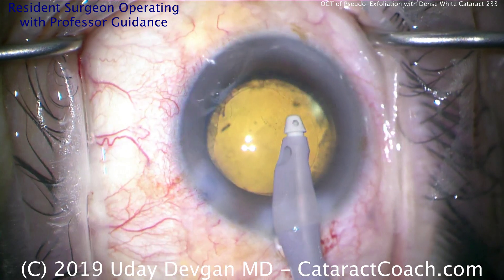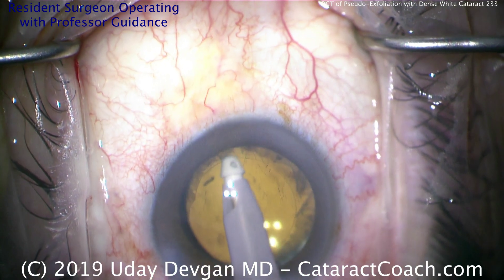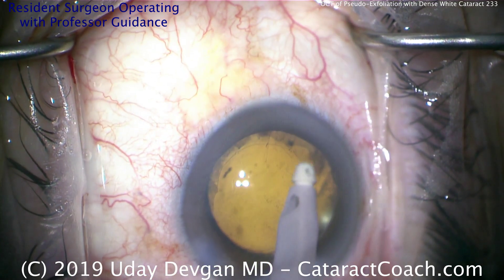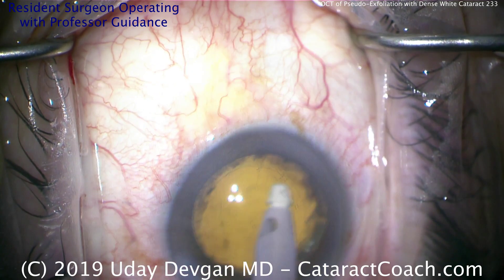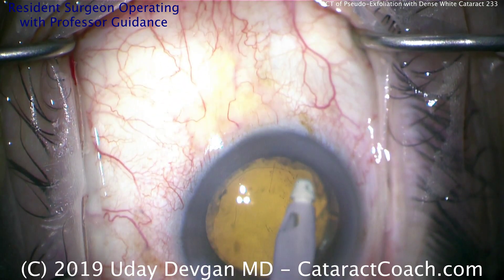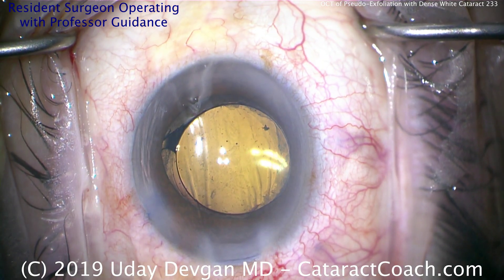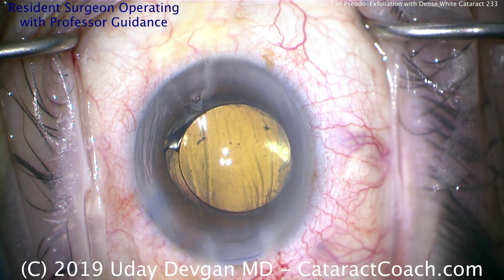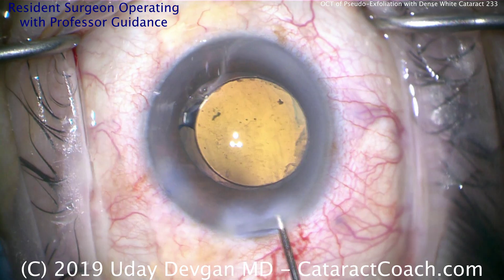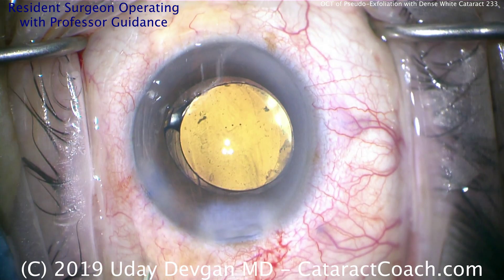That capsulorhexis size — let's judge that. Looks like it's a good 5mm capsulorhexis, given that the optic is 6mm in diameter. That looks great. Little tiny bits of cortex or lens material stuck there — I wouldn't sweat it. At this point, especially in a beginning surgeon's hands, the patient has had an amazing transformation from a completely blind patient with a white cataract to a nice, clear visual axis with a beautifully placed IOL. In medicine, it's the closest thing we have to a miracle — taking a patient with a dense white cataract and in the course of a short surgery giving them back normal vision. That is truly awesome — that's why we go into this field.